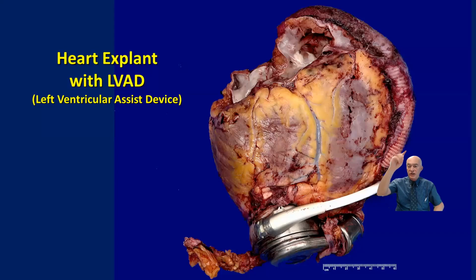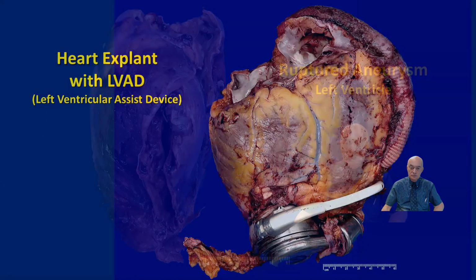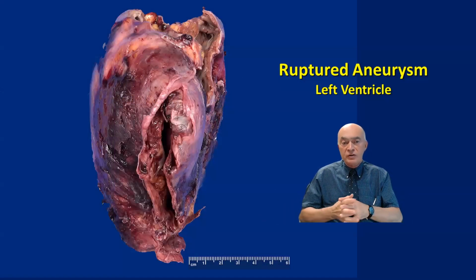And in this other area of the heart, you can also see that there is a tube that is also helping for the distribution of the blood that is connected to this specific device that you can see in the apex of the myocardium. And continue with examples of the different abnormalities that you can find.